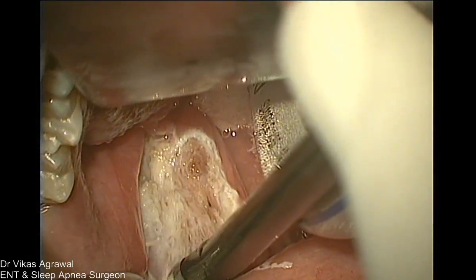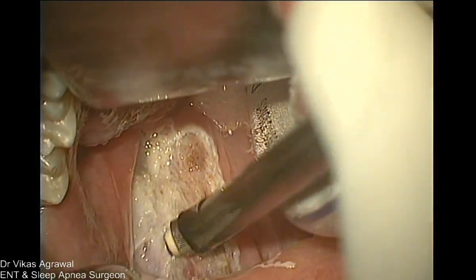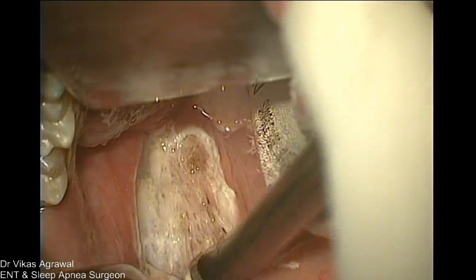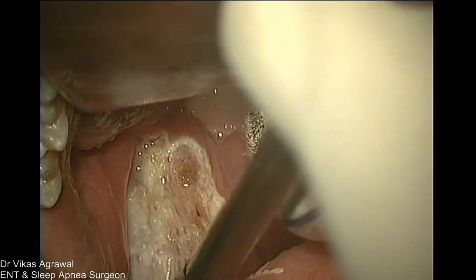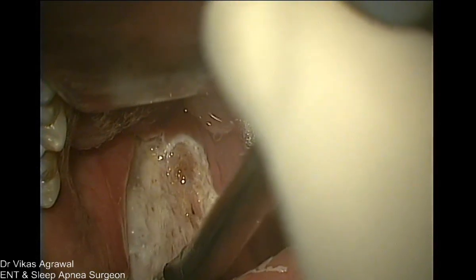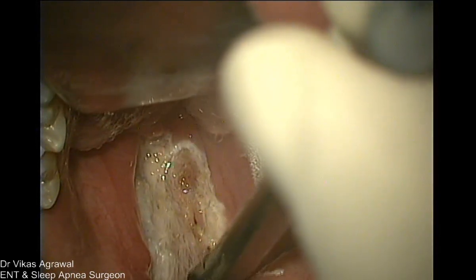Yeah, so I am coagulating it further, though it is behind the fascia. So there is no reason it should bleed. But paratonsillar vein, as I was telling you earlier, before starting, when we were not using microscopes and this technique, we never saw the paratonsillar vein. Now every single case we see the paratonsillar vein.